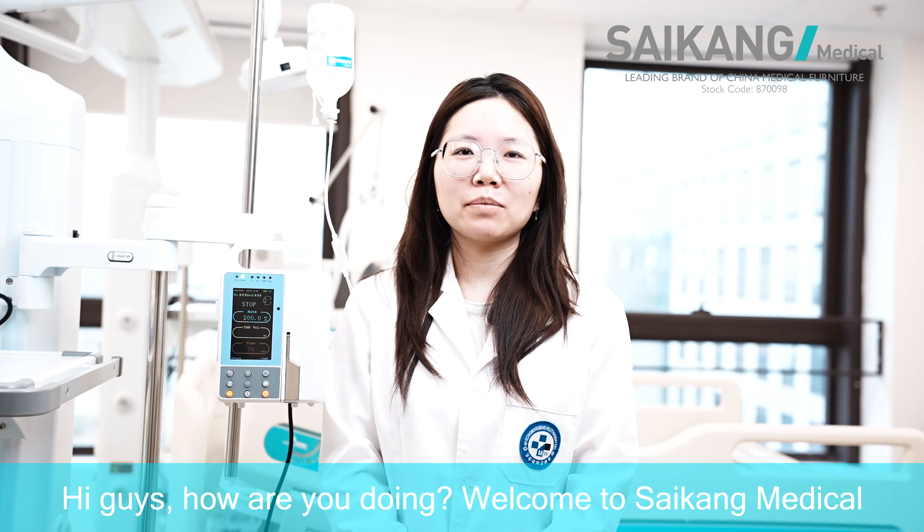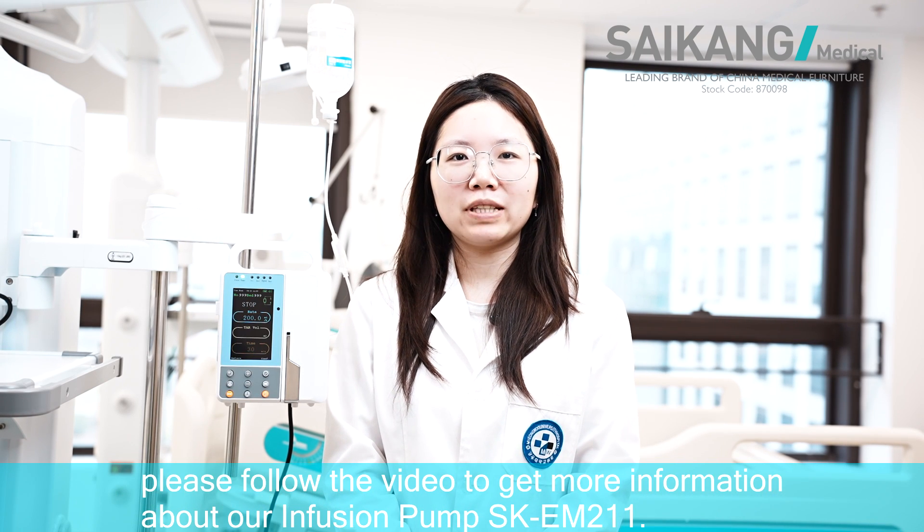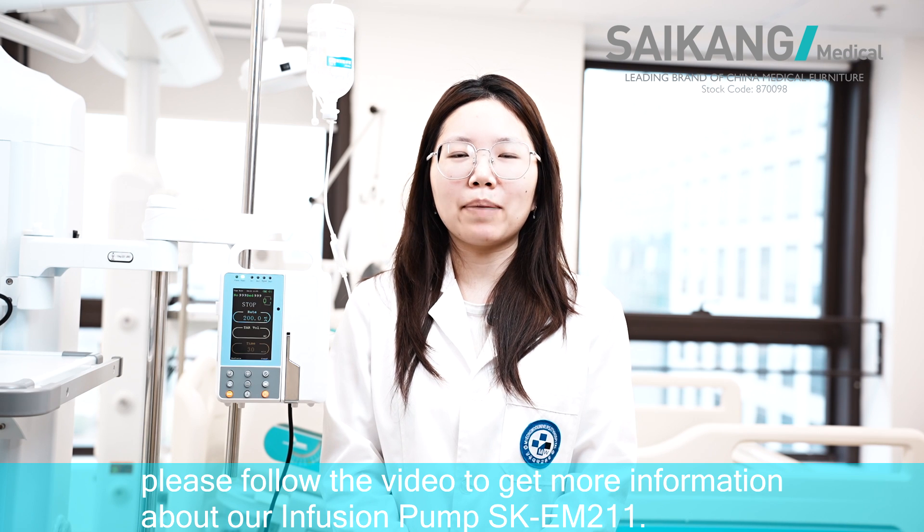Hi guys, how are you doing? Welcome to Saecom Medical. Please follow this video to get more information about our infusion pump SK-EM211.